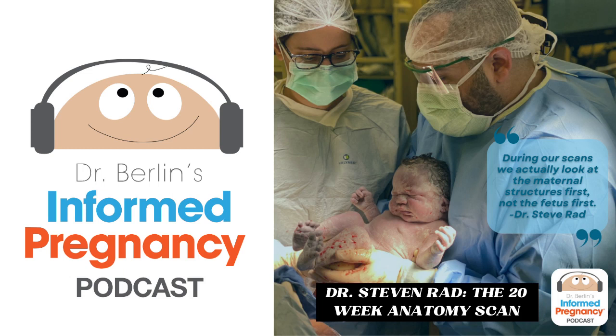I would say it can definitely be done by 16 weeks, if not earlier, by about 13 weeks. We can even do early fetal echoes now, which are ultrasounds of the baby's heart, which traditionally are done by pediatric cardiologists closer to 20 to 22 weeks. The later, the better, they prefer. We can see a lot of the structures as early as 13 weeks, even earlier, and detect abnormalities even in the first trimester.